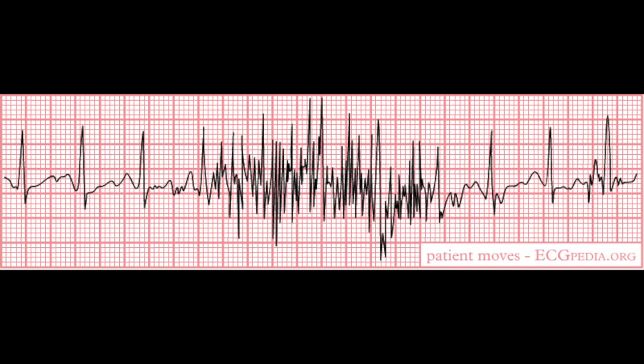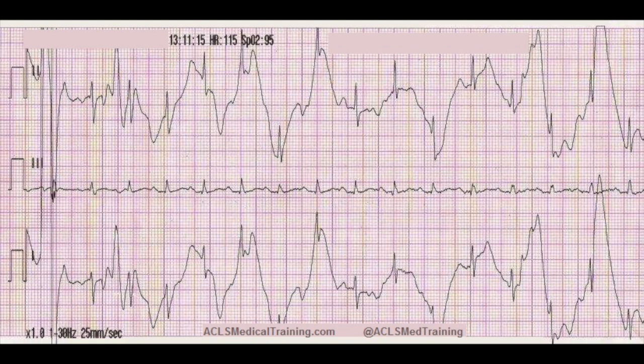The signals collected by an EKG monitor are very small. The heart's electrical signal is around 1 millivolt, and many waveforms are much less than that. So the EKG signal can be easily drowned out by other noise. The extraneous signals can be from other muscular movements, nearby electrical equipment, nearby power lines, poor electrode-to-skin contact, and from equipment in the monitor itself. The collected EKG signal must have the extra noise filtered out so that a clean picture of the heart's electrical activity can be shown more clearly. In short, noise is artifact. We've all seen artifact, and so thus we've all seen noise.